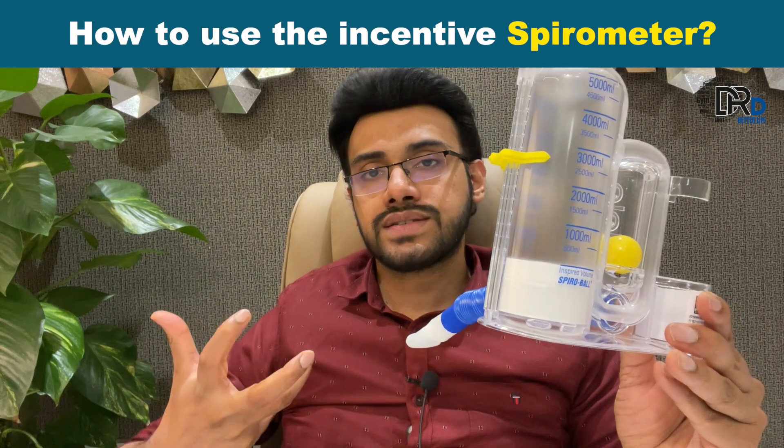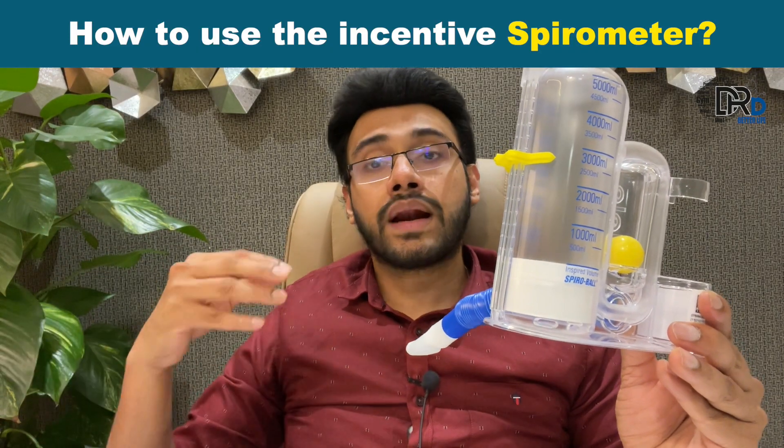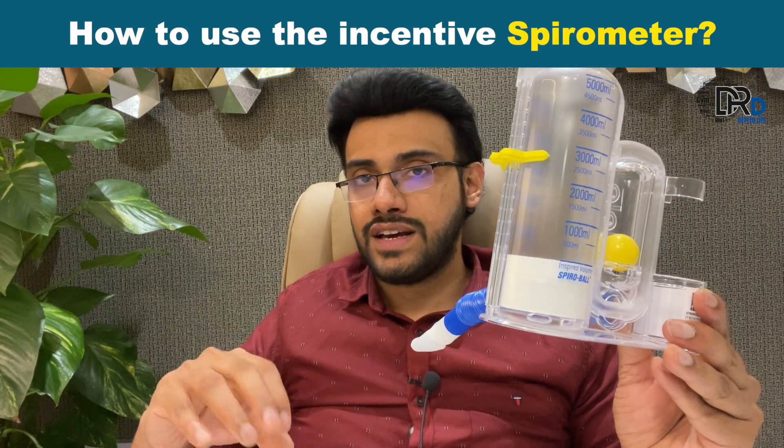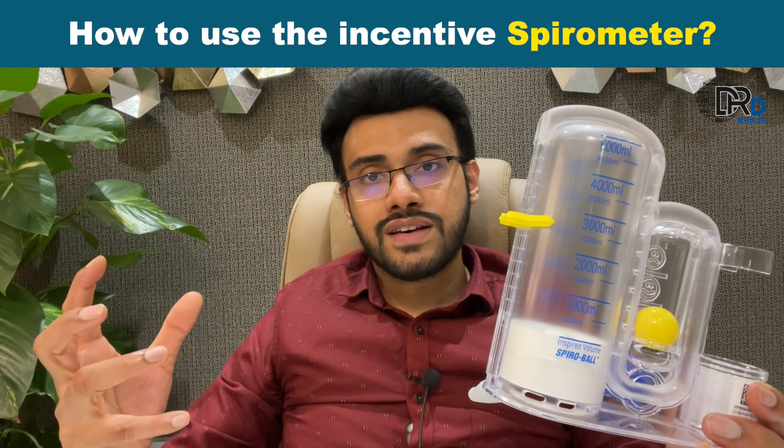That will expand your lungs and will push out the fluids which are in the alveoli, so the alveoli will not collapse. They will be expanded and you will get more airflow into your lungs, and your lung capacity will increase. So share this information with everyone — knowledge is important.